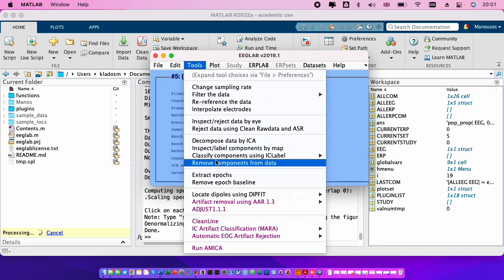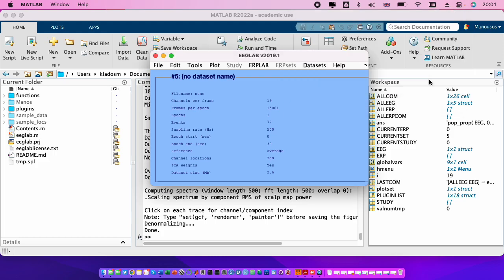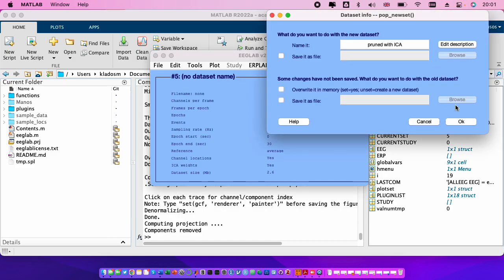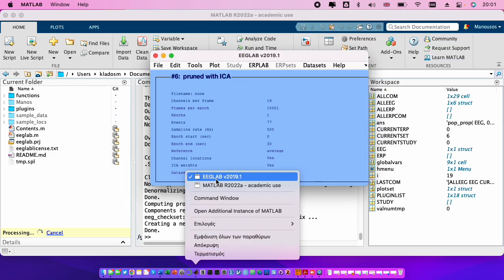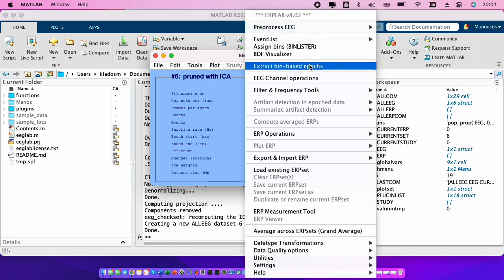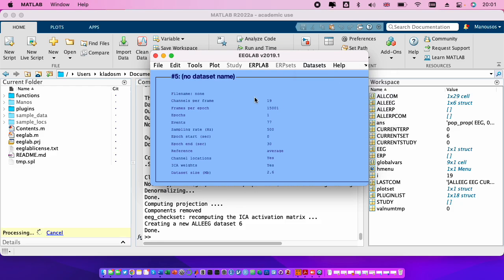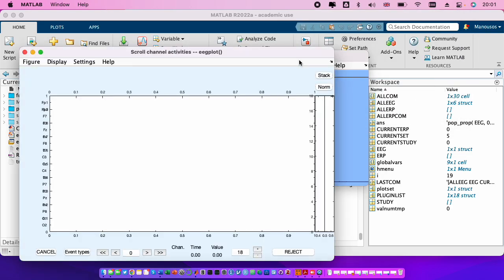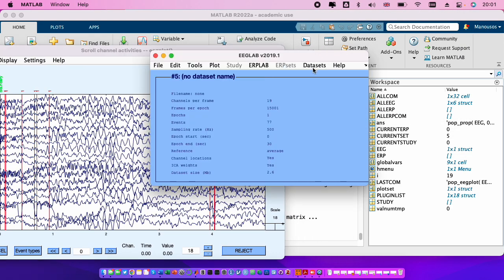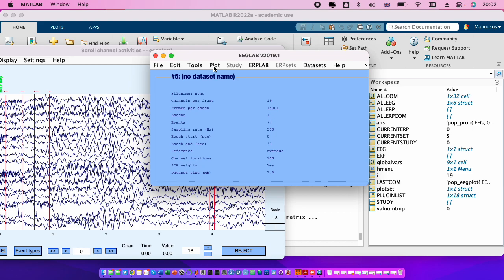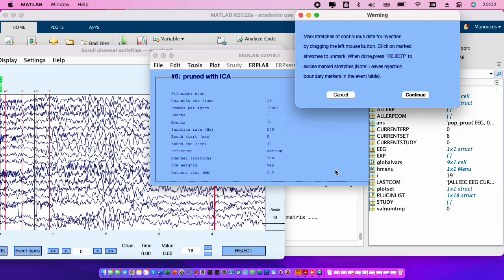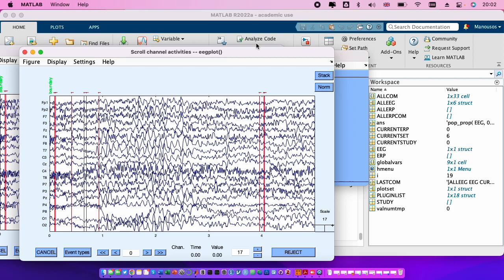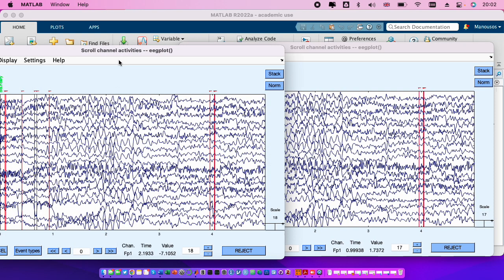So I think that this is the two components that should be removed. We close this, we press ok, and then we go to tools, remove components by data. There are already here one, six, we press ok, we accept. We press ok and then we didn't have the second. I go back one data set in order to have this for comparison purposes. Then this is the pre-ICA. Tools, inspect and check data by eye, continue.